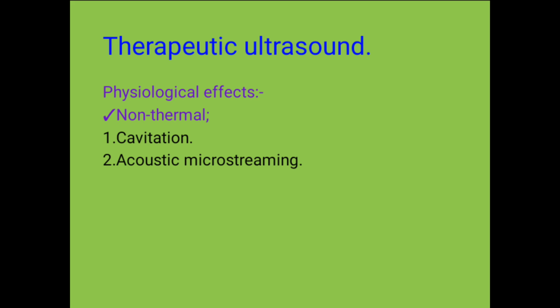Once you put it into contact with the surface of a person's body, you are not allowed to remove it because this will cause cavitation, which is the formation of microbubbles. And again, there's acoustic microstreaming. You will go and look at that.